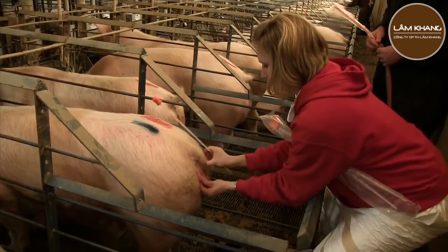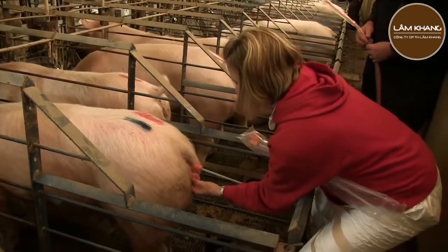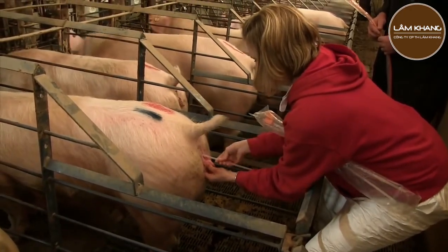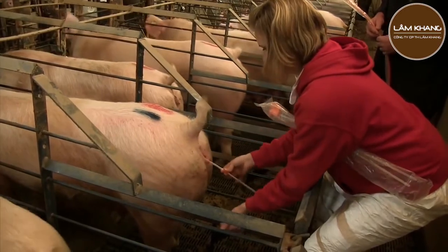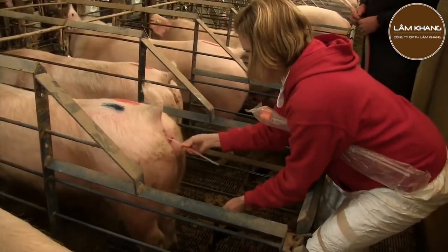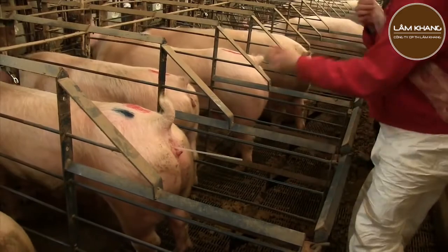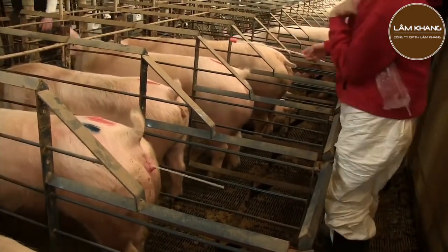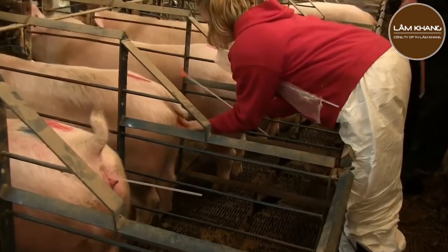Here I am behind 3 sows that were confirmed in estrus by boar exposure about 40 minutes prior to this recording. Since we're performing PCAI on post-wean sows, the boar should not be present during insemination. I'm spreading the vulvas open and inserting the outer portion of the PCAI rod into the vulva at a 45-degree angle through the vagina until it locks into the cervix.